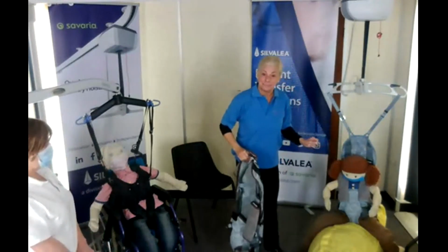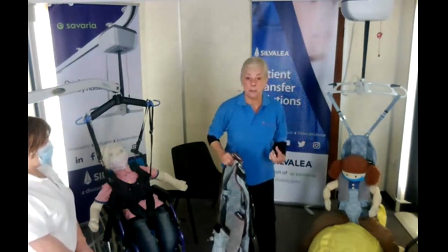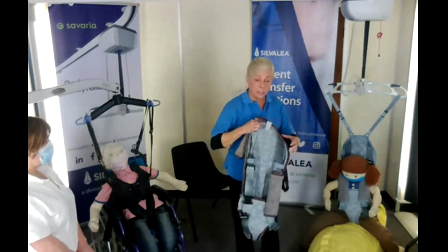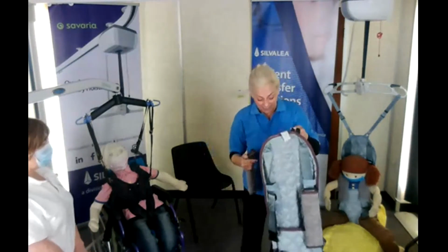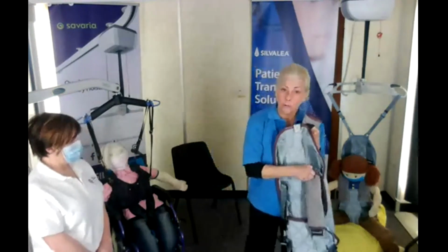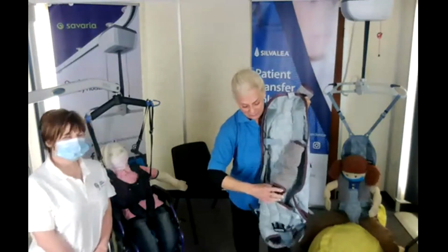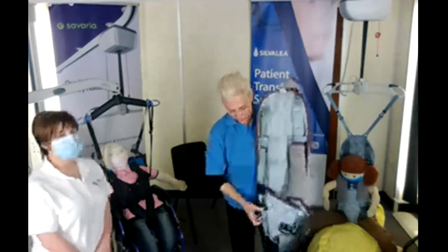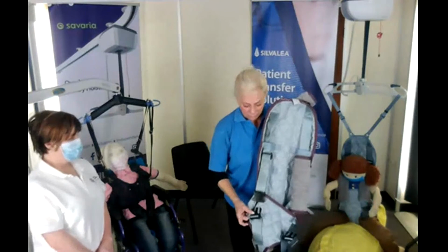Lots of freedom. So it's a really good shape, particularly for family inclusion activities. So certainly it's a very good supportive sling. A bit more fiddly to put on because you've got to roll, and roll, to be honest, to get the harness on. I think we've got a little slideshow, which I think, Alice, if you would kindly just play, and then I can talk through it and show you what I'm referring to there.